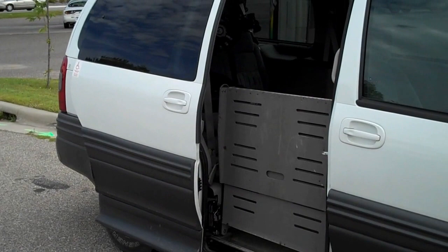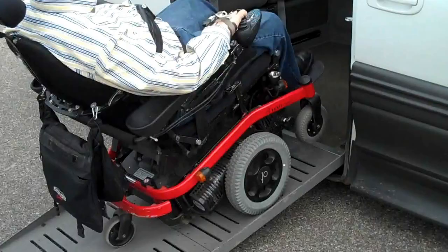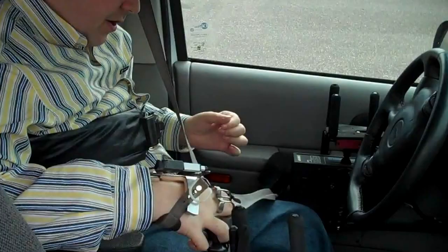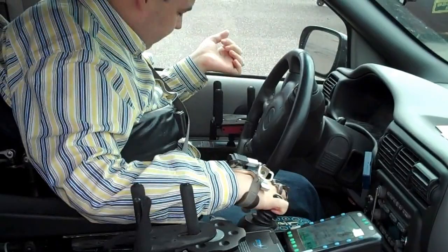Here's my van, so I decided to show you how I drive. Here I just pull into the driver's position, and my wheelchair locks in place, like a semi-truck trailer.